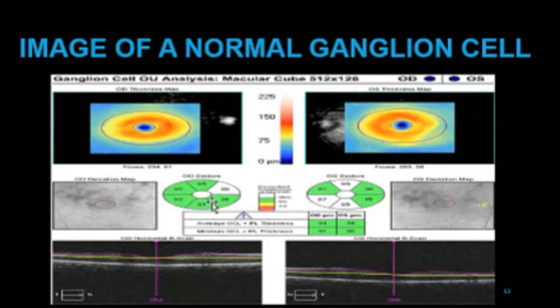If you look at this pie chart, you find that this place is white in color. Have you seen it? White here is green in color. Can you appreciate it? Yes. So the white here means that this place is above normal. This is a healthy result, remember. And green here indicates that everything here is also within normal, just that this place is more healthy. For the left eye, you find that here is white, which also indicates that this place is healthy. The green also indicates that they are healthy, just that the white shows that it's more healthy than the green part.